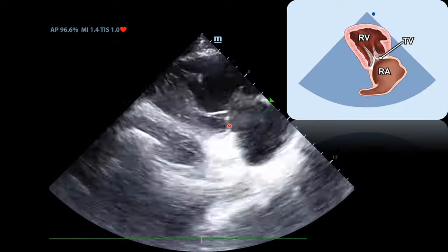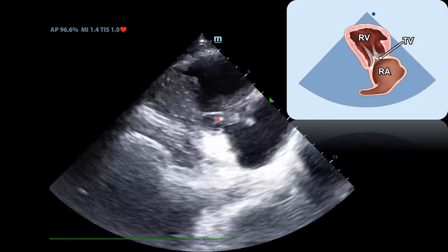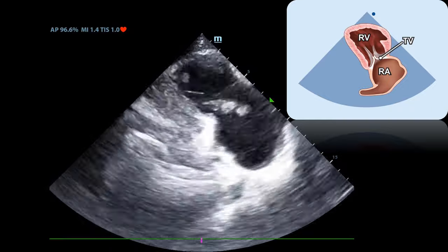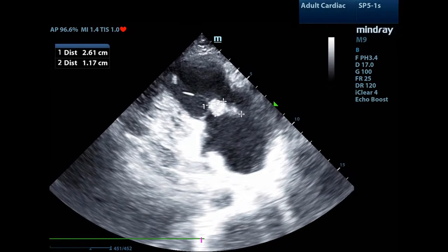You'll notice that there is an abnormality of the tricuspid valve here. I have frozen the clip to identify a mobile mass that is located on the tricuspid valve that measures 2.6 by 1.2 centimeters.